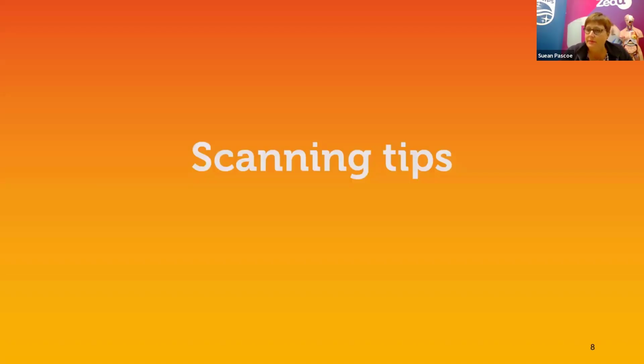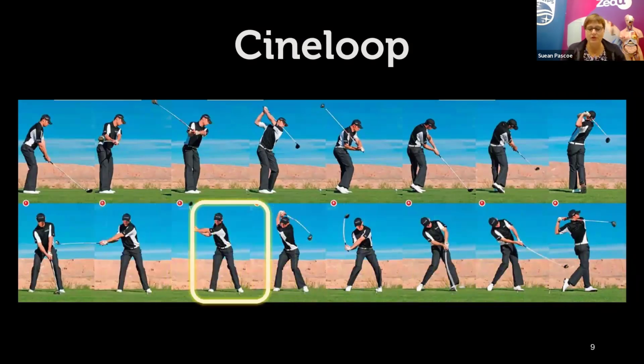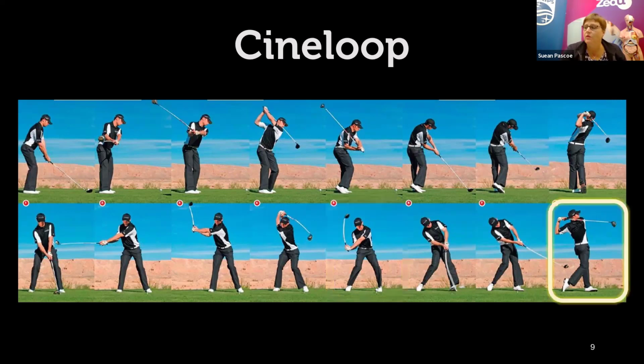So some scanning tips here. Your biggest friend when you're looking at the bile duct is the cine button. Now, just remember that when you push the freeze, I think this is one of the most underutilized buttons on the machine. When you push the freeze button, the system will store in its short-term memory anything up to 200, 255 frames, depending on which machine you're using. And so when you push freeze, you can then rewind.